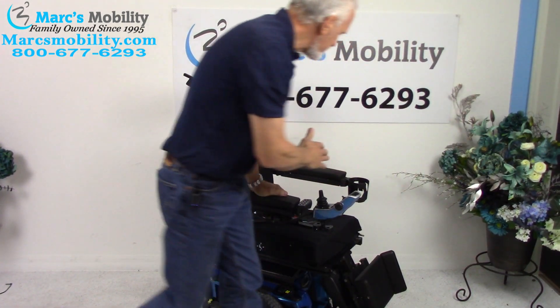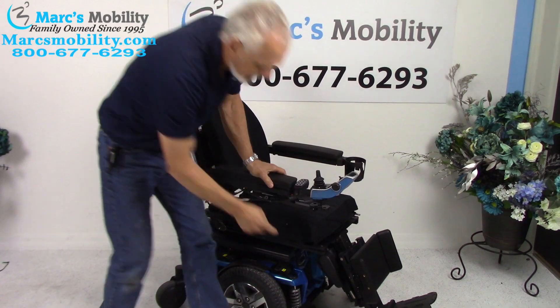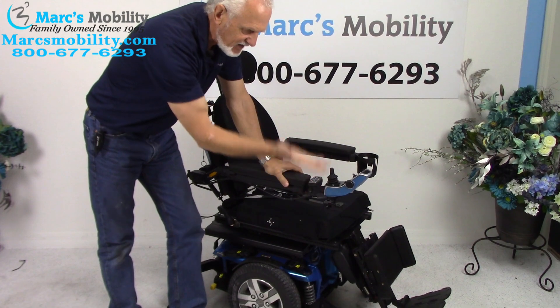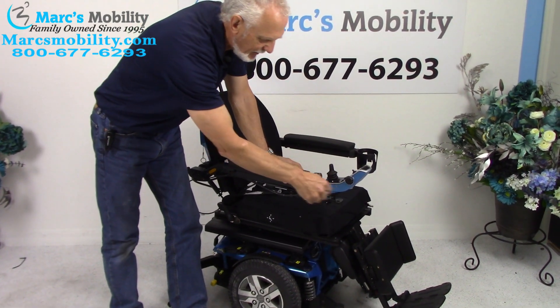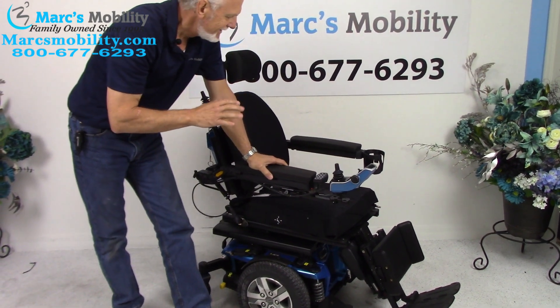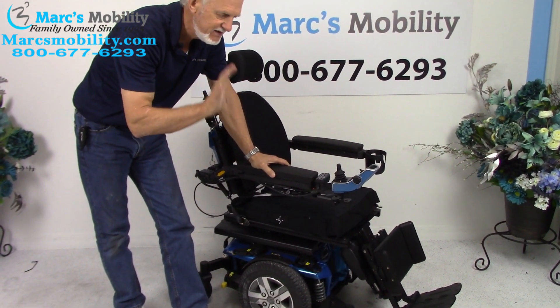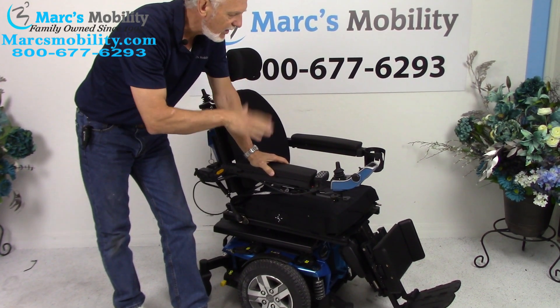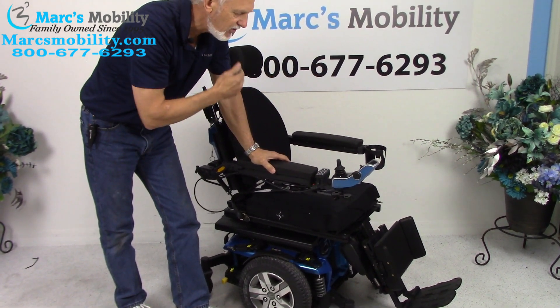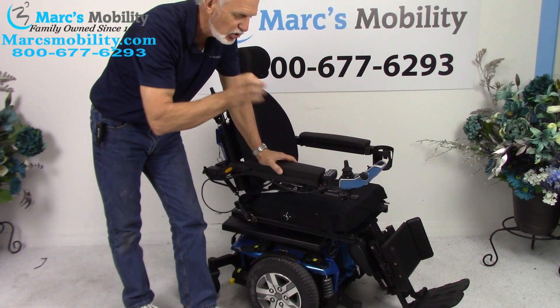There are two batteries in this chair — they're 55-amp batteries. They come out from the front; you have to have the seat elevated or tilted to get the batteries out. They're supposed to give you about 15 miles on a battery charge, but that distance varies depending on how you drive, what surface you're on, whether you're going uphill, and the weight of the user. You might get more or less than 15 miles.